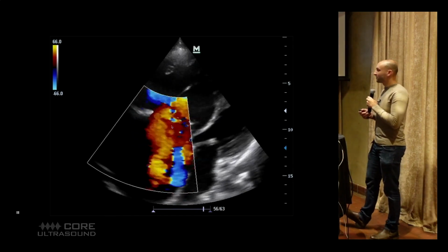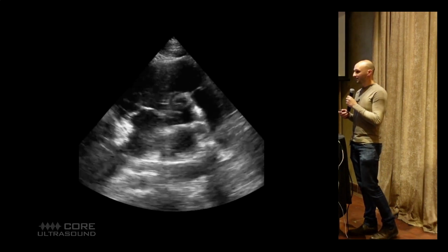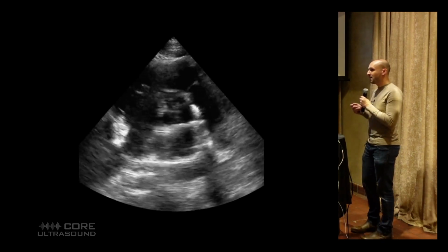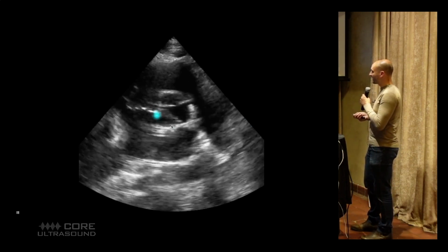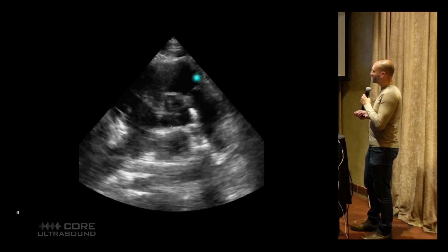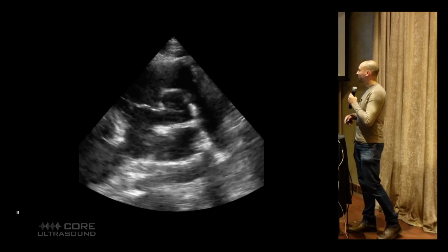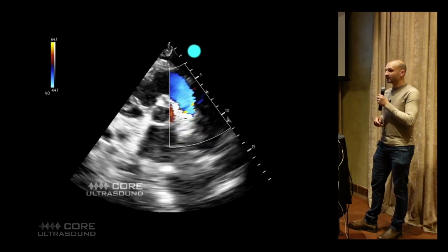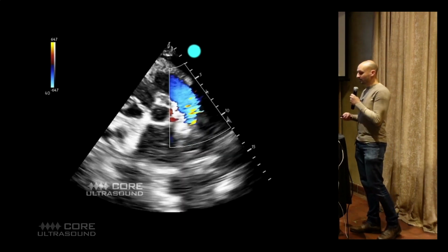One of my favorite things to look at more recently is the RVOT, because it can actually be pretty helpful. This is a high parasternal short axis view. This is the aortic valve in cross section. This right here is a tricuspid valve. This right here is the pulmonic valve. And you can actually look for pulmonic regurg by putting your color Doppler gate on that area. You guys see that little tiny red flame? It's just a little bit of pulmonic regurg right there.